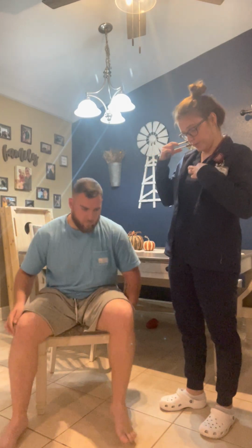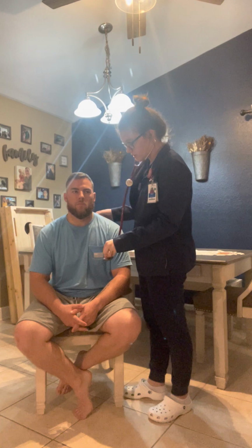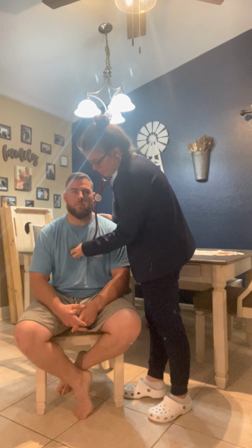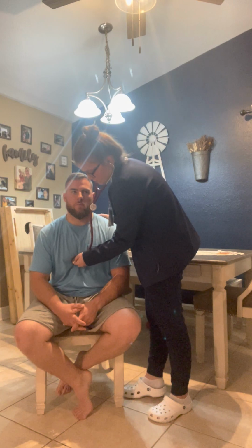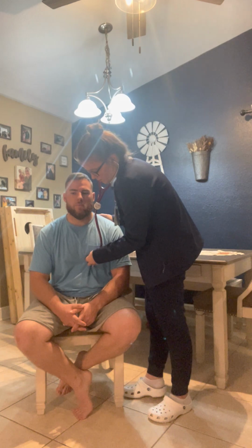Next, I'm going to start to listen to breath sounds. So there are 3 different types of breath sounds: bronchial, bronchovesicular, and vesicular sounds. It starts at the top and goes down. So there's quite a few spots I'm going to listen to. Every time you feel my stethoscope move, just take a deep breath for me. We're listening to the upper lobes, which is the bronchial sounds. Bronchovesicular. You're not going to hear bronchial sounds on the back. They're mostly over the trachea. So you really want to get a good listen to those on the front.